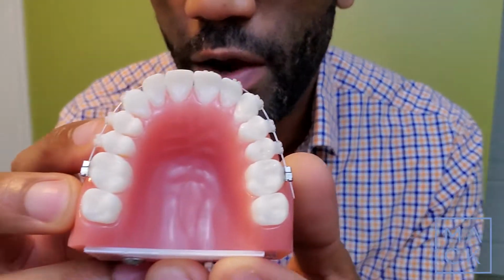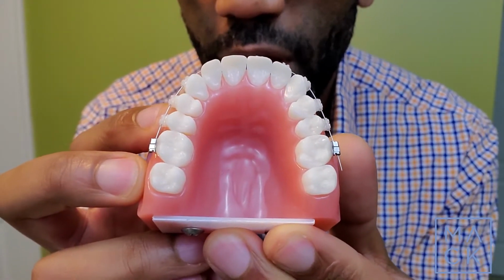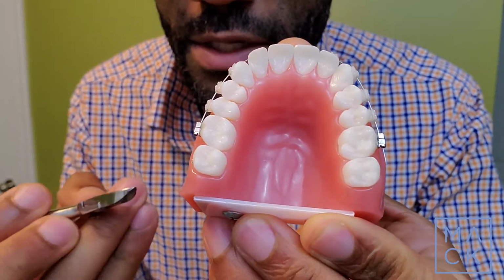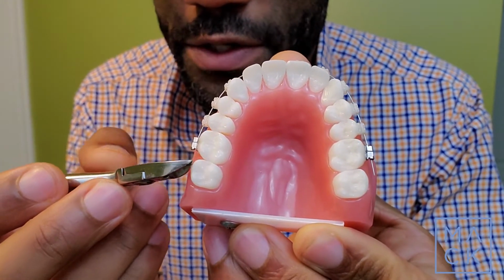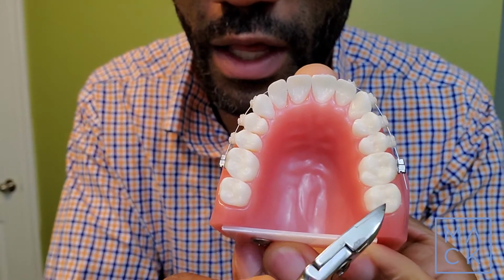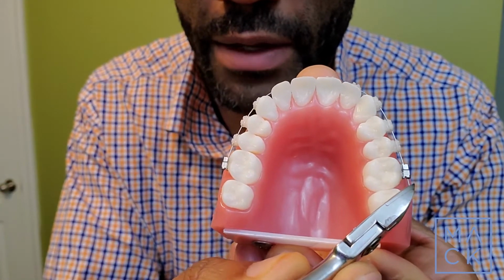I just wanted to take a few minutes to talk about how to deal with pokey wires. There's a couple of different reasons that you might have a pokey wire. Reason number one, and the most common, is that you have a wire that has shifted in your mouth. In this case, on one side there's no wire sticking out the back, and on the other side there's a lot of extra wire sticking out of the back.